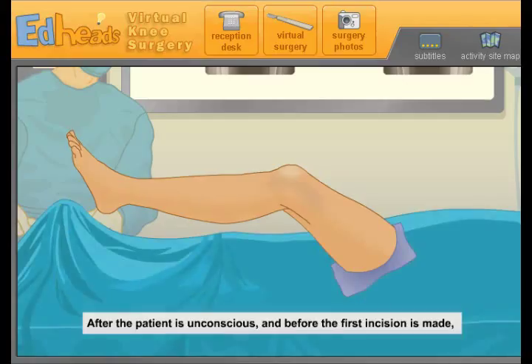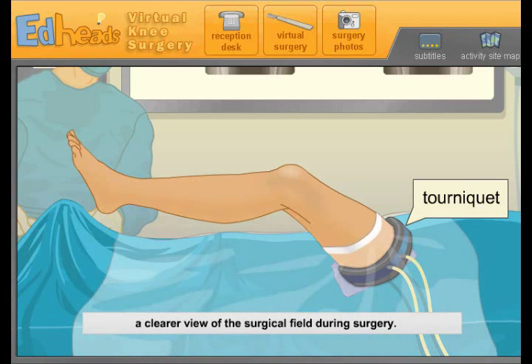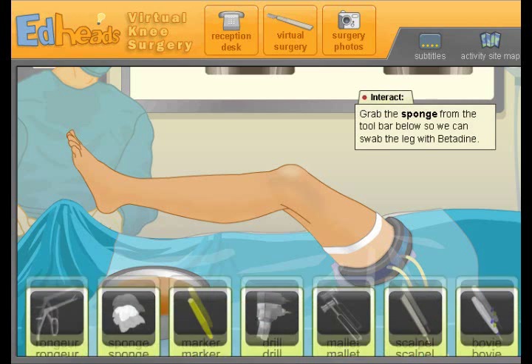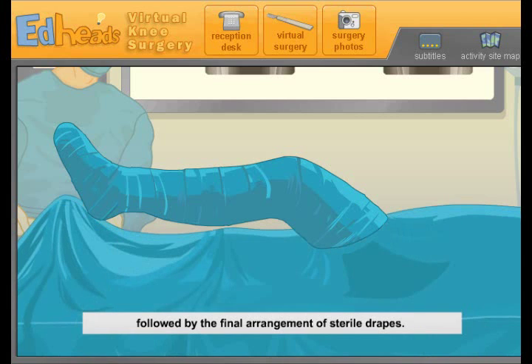After the patient is unconscious and before the first incision is made, we need to establish a sterile field around the surgical area. A series of sterile drapes isolates the surgical field from the rest of the patient's body. A tourniquet is applied to cut off blood flow, which allows a clearer view of the surgical field during surgery — so there's no blood everywhere. To kill the bacteria on the patient's leg, clean it in a betadine solution; this scrubbing process will limit the chance of bacterial infection.